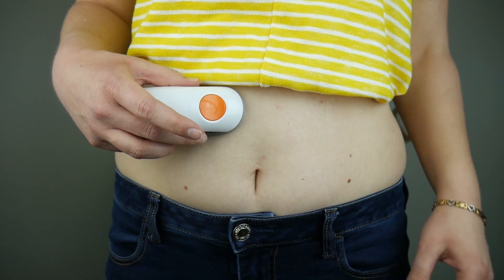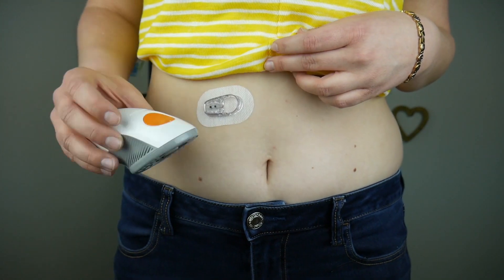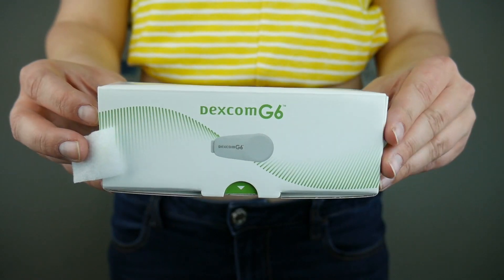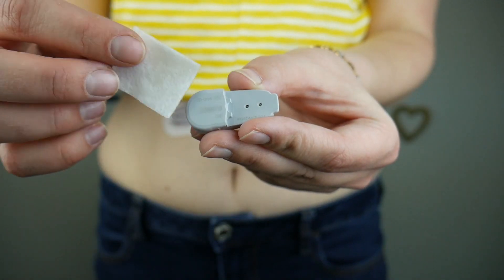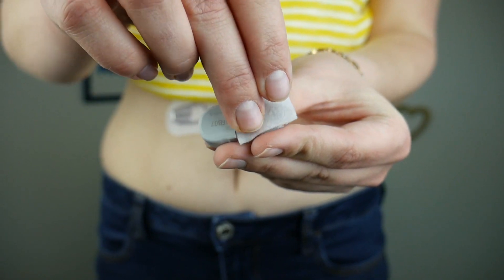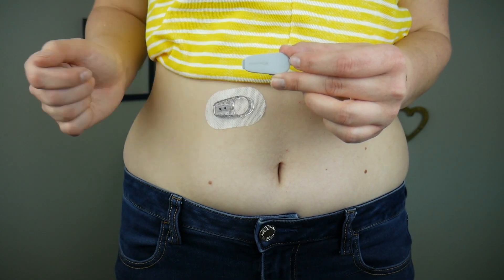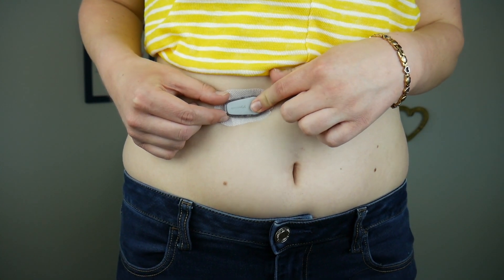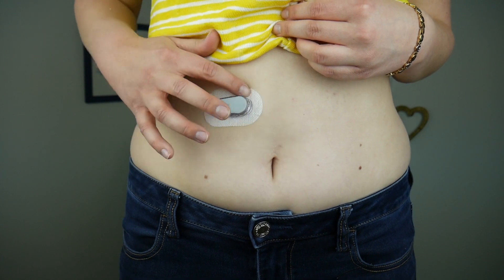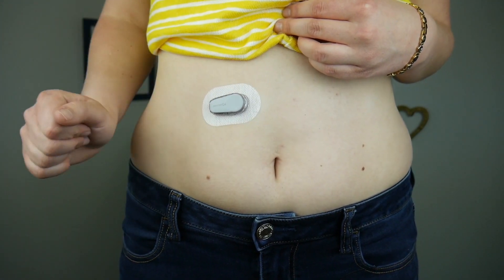There we go — boom, it's in. I love how easy it is to pull off the inserter once it's in. Now I'm going to take my transmitter out and clean the back with alcohol. Next I'm going to insert the tab of the transmitter into the sensor and snap it into place. Then just circle around the adhesive three times and you're good to go.